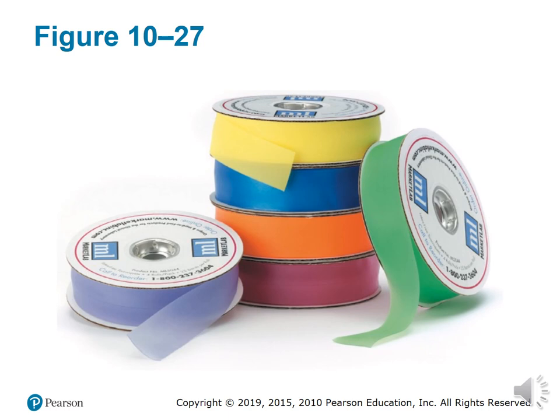Here's what the single use non-latex tourniquets look like. They're really, really thin. They look like paper. It would be impossible to clean these, and you'll be able to identify the difference in them by the texture. You see, we use the non-latex rubber ones, and after dealing with these for the duration that you're in school, you go to a facility where they have these paper disposable ones, you'll be able to tell the difference. You can almost visibly see the difference. Yeah, they're transparent.